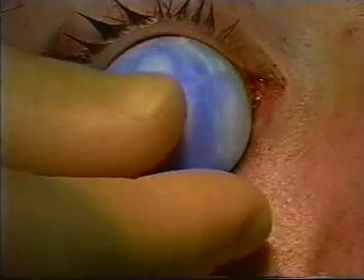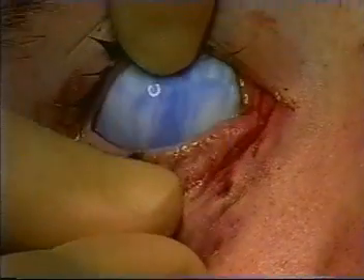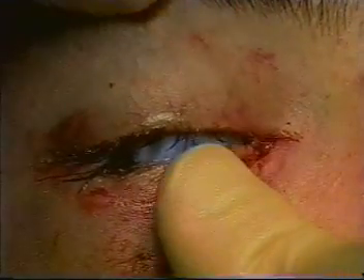A scleral shell is essential, allowing the patient to be more comfortable and prevent damage to the cornea during the surgery.